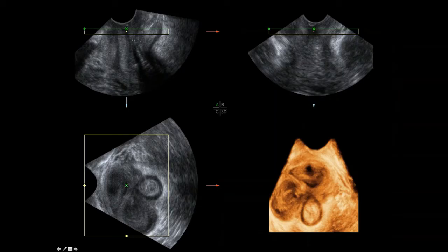Now here's another patient. This one was symptomatic. So there's a mass really along the side of the rectum this time. You can see it right here. It's not a cystic mass. It's a sort of ugly mass, probably more solid or filled with debris. But instead of being near the vagina or near the urethra, it's actually near the rectum. So here I've taken my sweep right there. So this tells me that this is quite superficial. This is quite near the introitus, near really the anus, if you will.